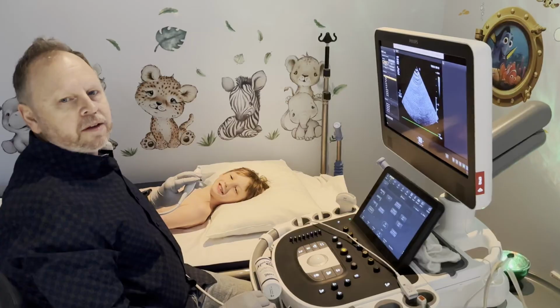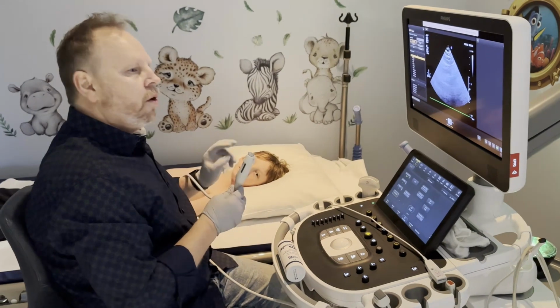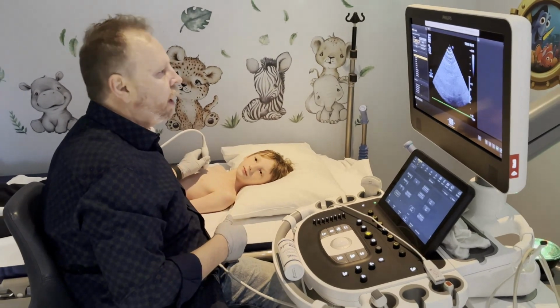In my practice, I've got a patient waiting for us, and we're going to show how to get these coronary arteries so that you can see how easy it is and how fun it is to do. All right, I'm ready. First thing we're going to start with, we're going to get our reference picture. And our reference picture in this instance is looking for our parasternal long axis picture.